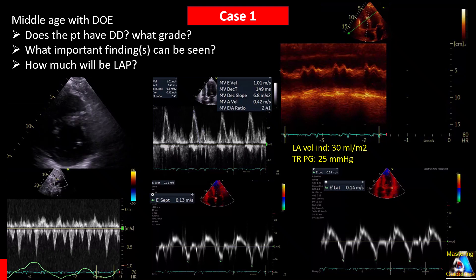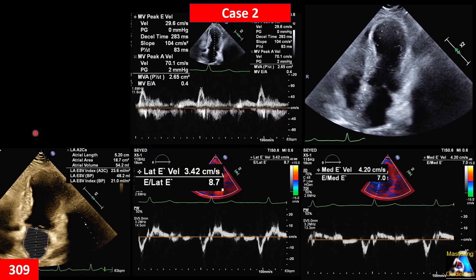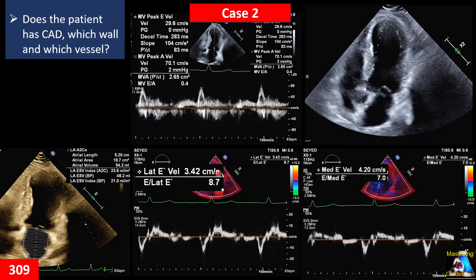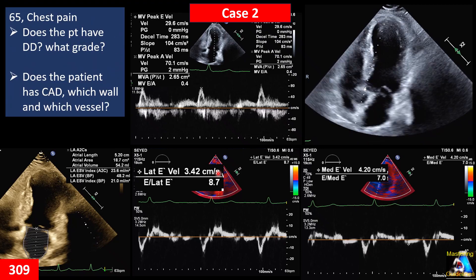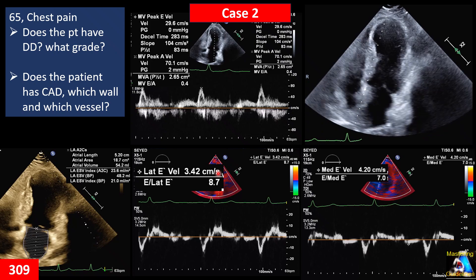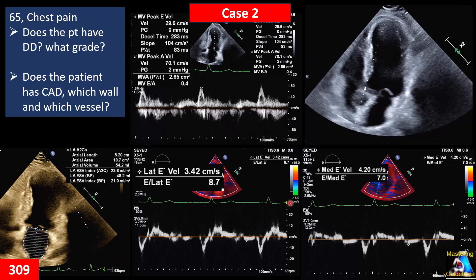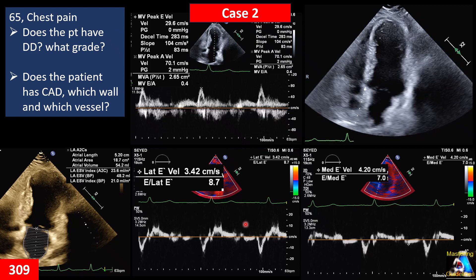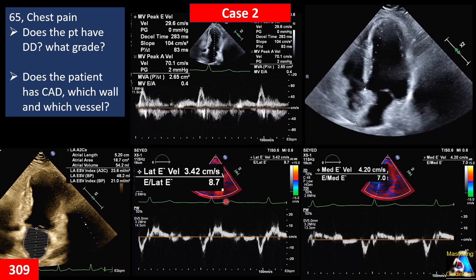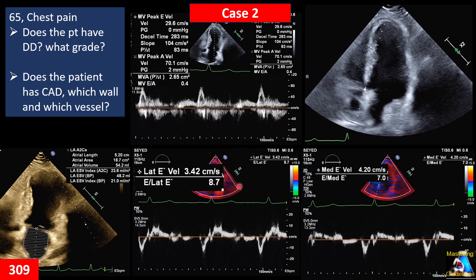Now let's go to the next case. Here we have a 65-year-old patient with chest pain. An echo was performed and we got these findings. Does the patient have diastolic dysfunction or not? If so, what type and what grade? All the numbers are visible. Second, does the patient have wall motion abnormality? If so, which walls and which vessel is involved?